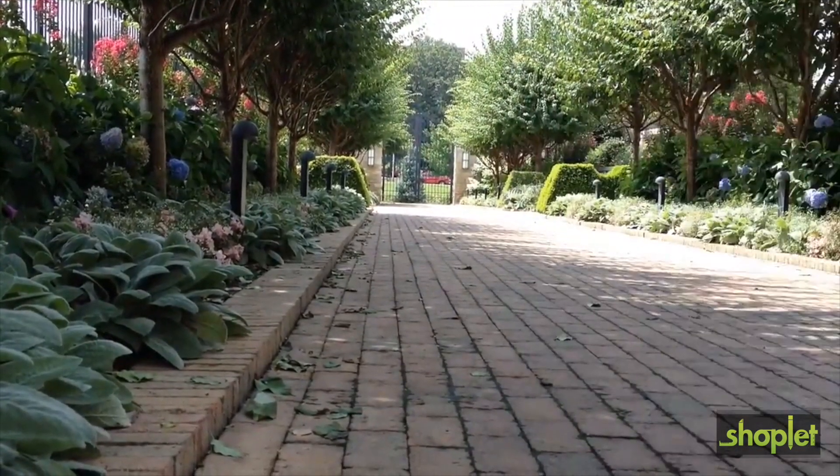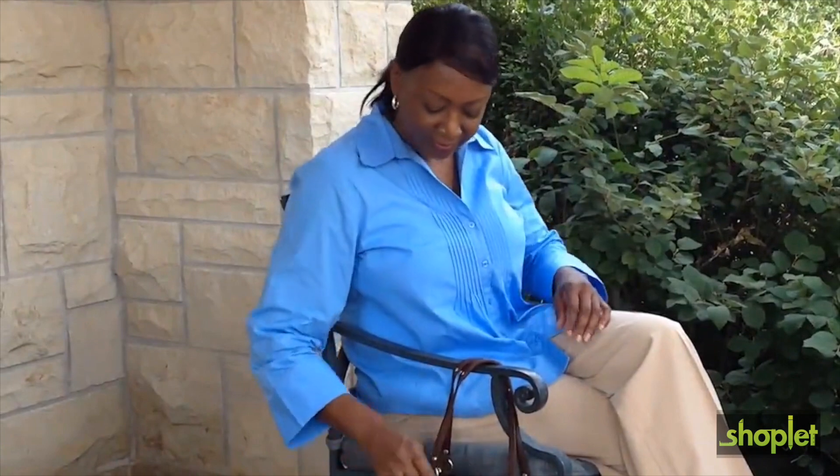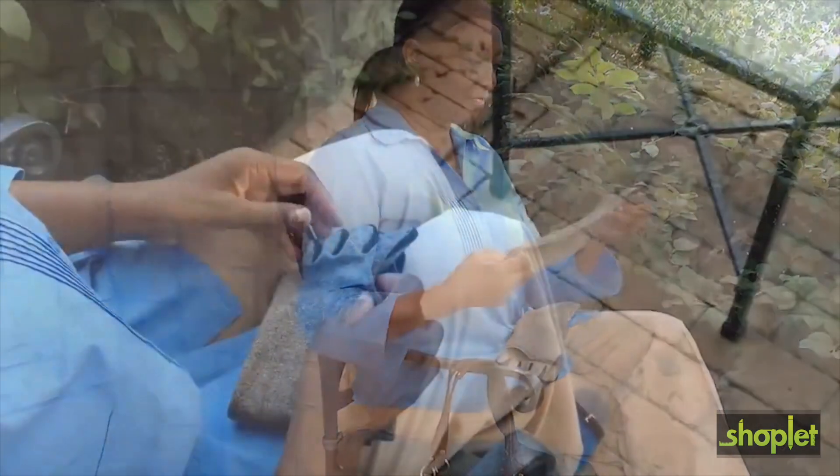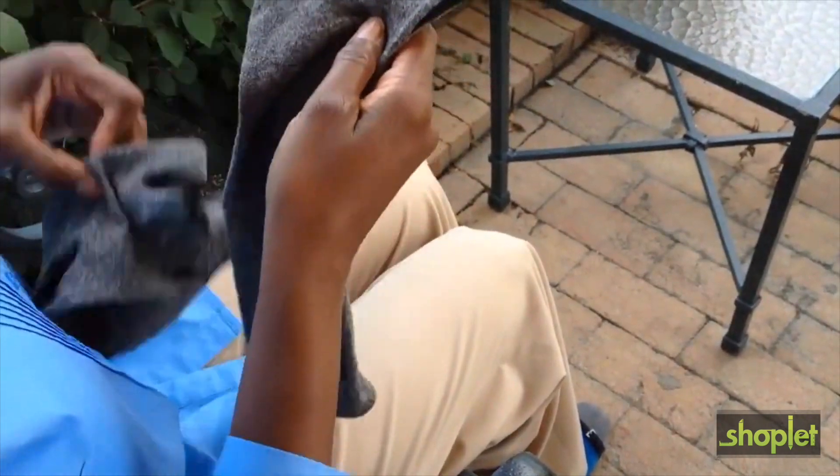Backed by the IMAC Comfort Guarantee, arthritis socks utilize a unique design that provides mild compression, warmth, and increased circulation to help promote healing.